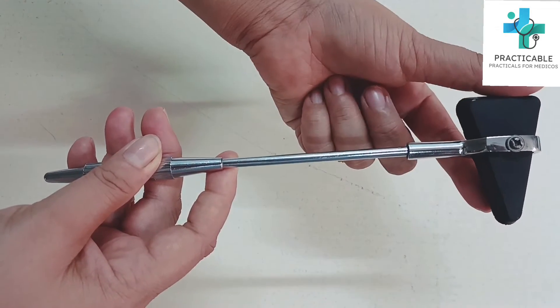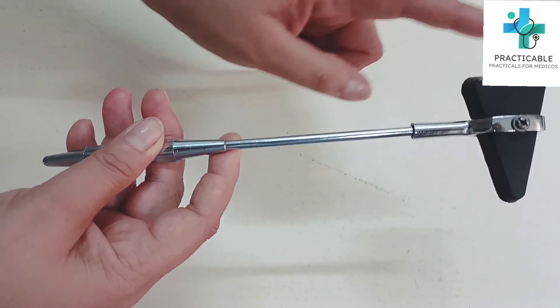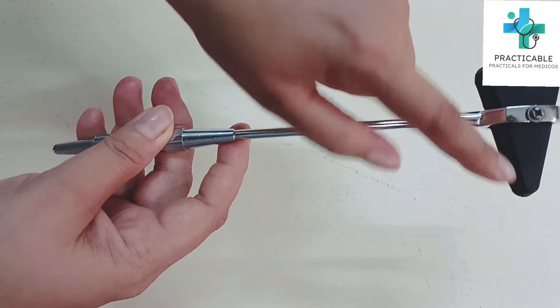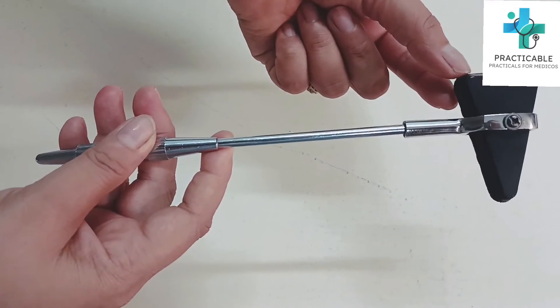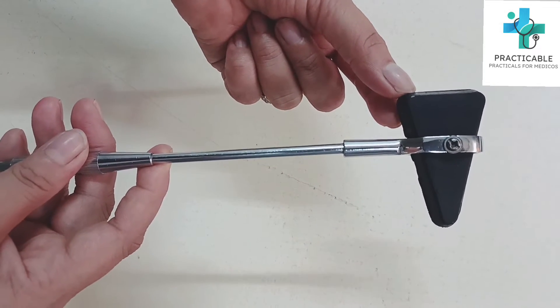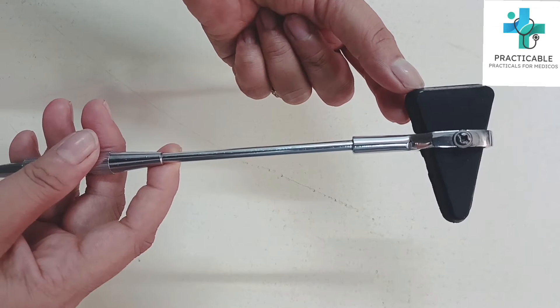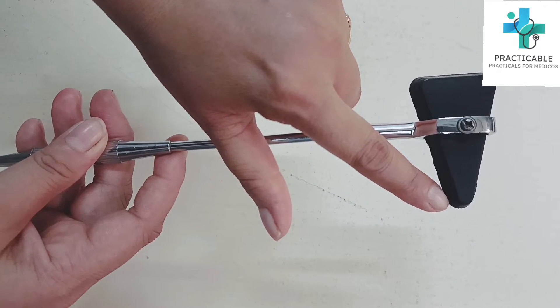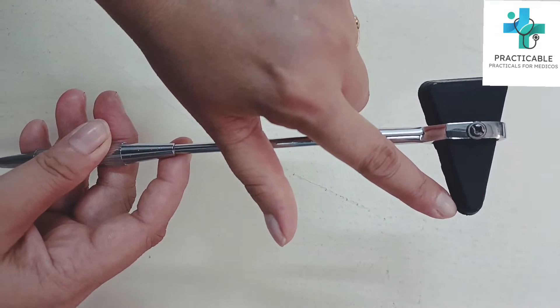The rubber piece has two ends - one broad end and one pointed end. The broad end is used when the muscle tendon belly is broad and thin, like the triceps. The pointed end is used when the tendon is stout and narrow, like the biceps.